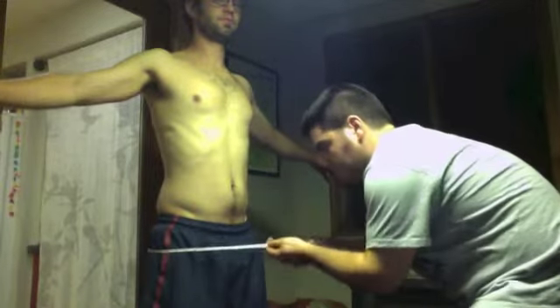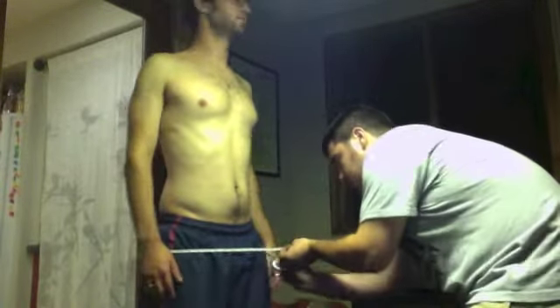And for a second measurement, hold your arms up. And then slide them back down. 39.5.